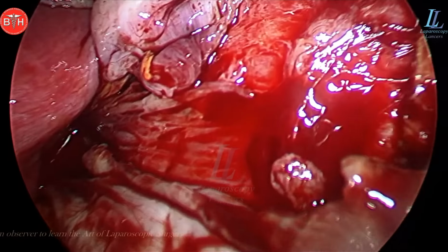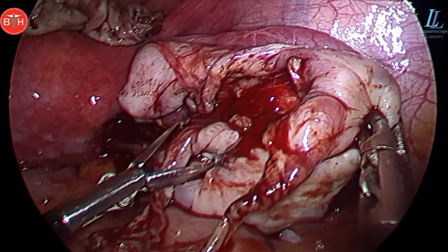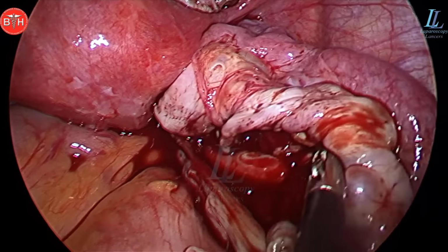So that's the ovarian tissue I am holding on the right side. Quite a bit of ovarian tissue that is remaining. So, and maybe in 2 to 3 months this will shrink to form a normal ovary.